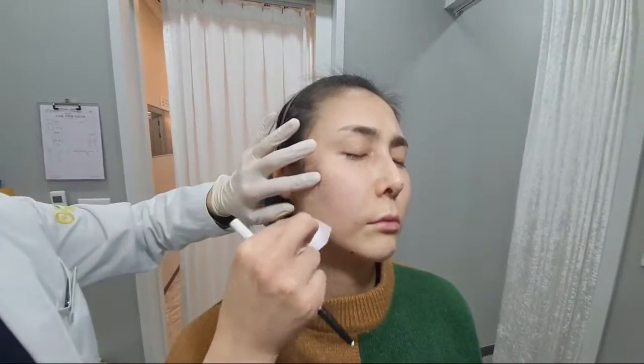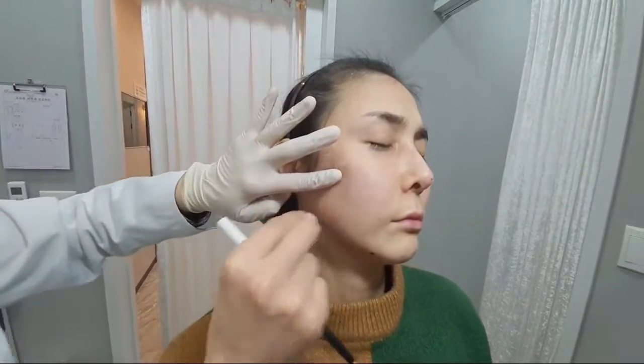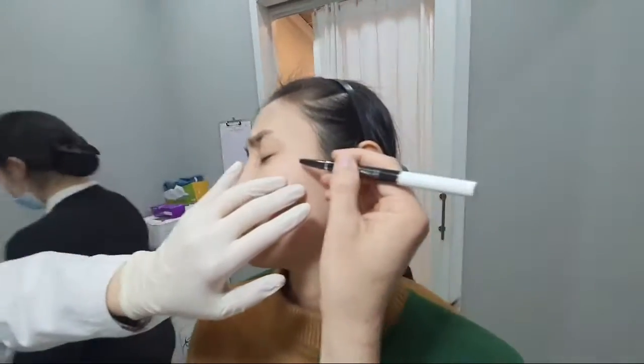As we've been mentioning multiple times, when you're performing filler or thread sessions, Dr. Rowe prefers to do the procedure in a vertical position sitting down. A lot of doctors may do the procedures while lying down, but you get the most natural results when you're sitting down in a vertical position.